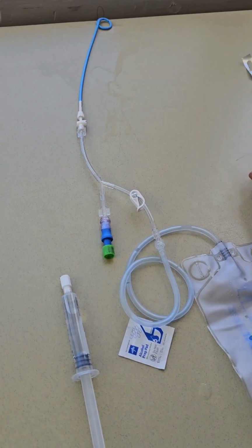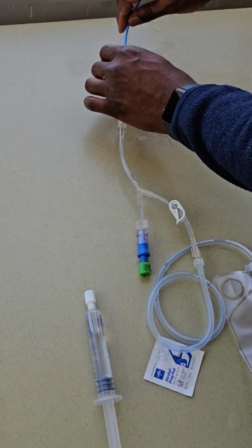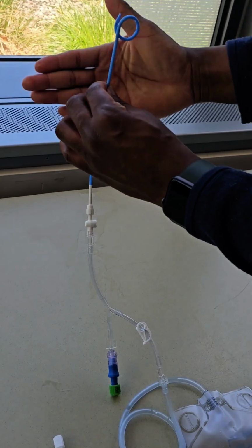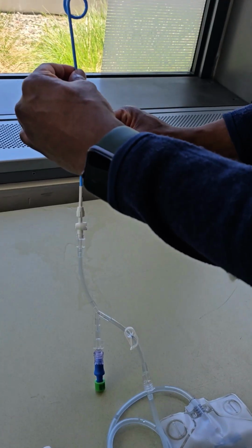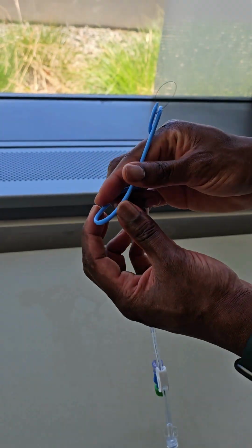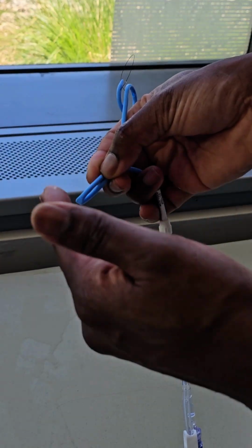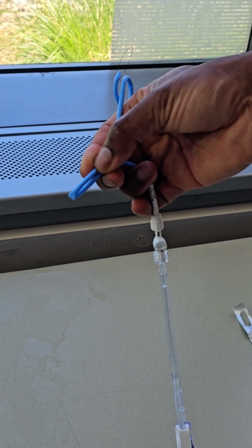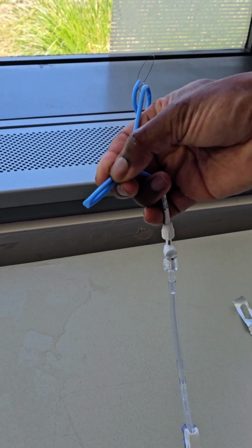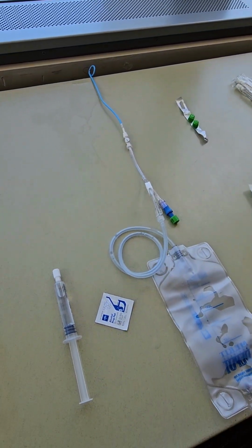Another thing that I have seen sometimes is, if you remember, you can only see this part of the drain coming out of the patient. When the dressings are done, sometimes what will happen is the drain will be brought forward to the front of the patient. For example, for a PCN, if this is the patient's back, when the dressings are placed, the drain is brought to the front. And what that essentially does is that it kinks the drain and prevents it from draining. Sometimes this is hard to see because this part of the drain is underneath some of the dressing. So it might be necessary to take down the dressing to look at it. But if you're getting to that point in terms of troubleshooting the drain, then it's probably best to call IR to let them come and do that part of troubleshooting.